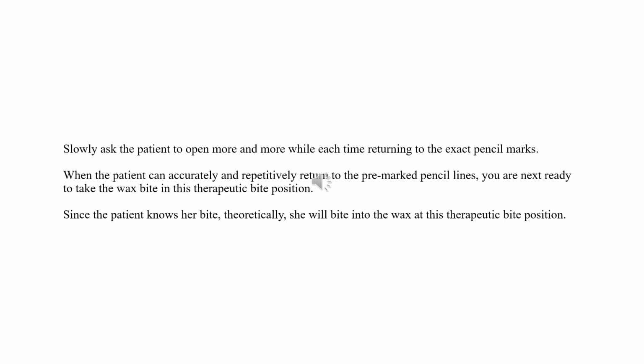So when the patient can accurately and repetitively return to the pre-marked pencil lines, you're next ready to take the wax construction bite in this therapeutic bite position. Now, since the patient knows her bite, theoretically, in theory, she does, but there's going to be a lot of things going on that are going to prevent her perhaps from biting into that once the wax is in, but you still have to keep yourself being aware of what's going on.